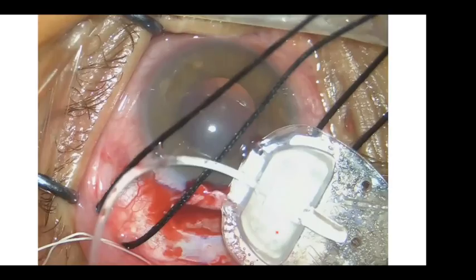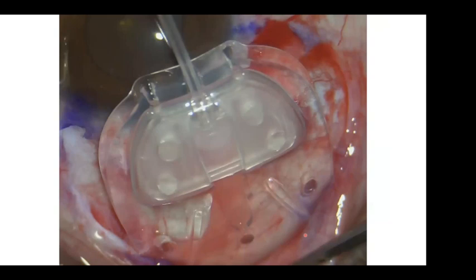Then I do priming, as you know, by injection through the valve. We do not inject vigorously, because you can damage the membranes; inject gently. Once you see the fluid coming, that's enough. And then the implant should go smoothly. And one of the tips here is that I use the artery forceps to separate the Tenon's layer, so that I don't use scissors, because scissors sometimes can damage the tissues.